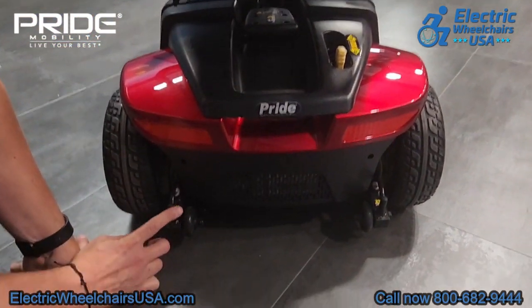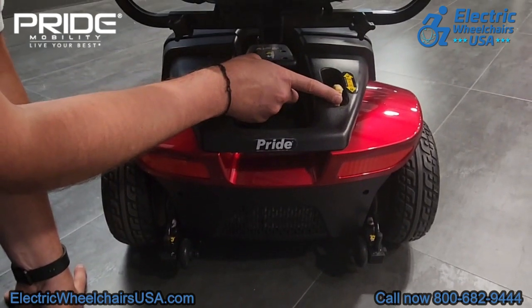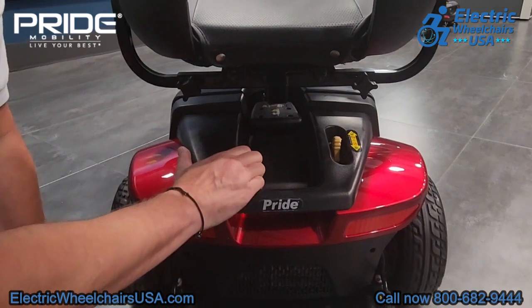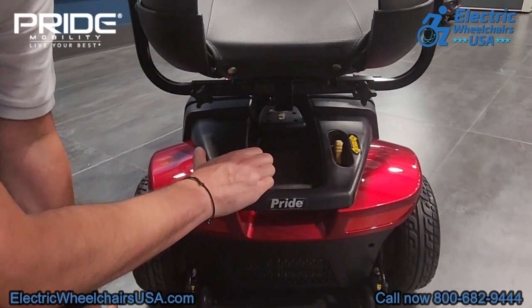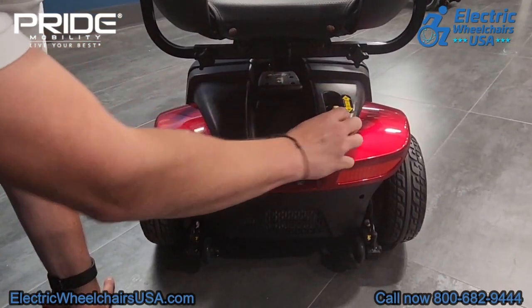These are your anti-tip wheels for added safety. This yellow lever is your freewheel lever. If you run out of battery, just press it forward — that puts the scooter into a neutral position so you can push the scooter. You can't operate it when it's in freewheel mode. In order to operate it, you have to press the lever back down, which puts it into drive.